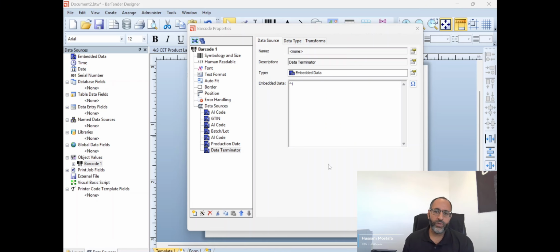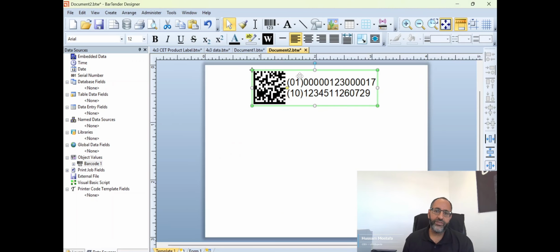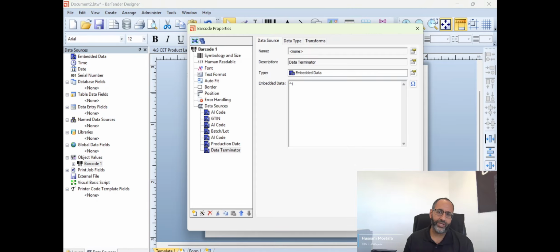Okay, so as we saw here, we have the global trade item number 01 followed by the next digits. The lot number is 12345, and 11 is the application identifier for the production date. And ideally, we want it to be in the next line below the lot number. So I'm going to double click on here. And the reason I believe it's coming next to the lot number is because this data terminator is right here, and I believe it should actually be after the lot number.